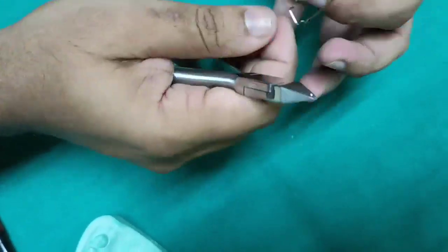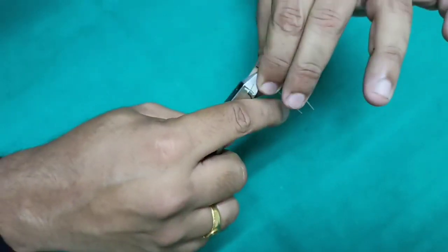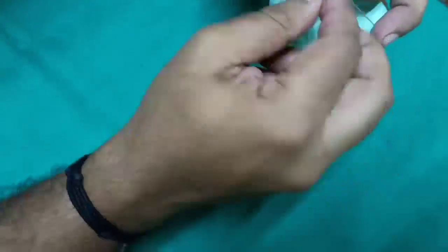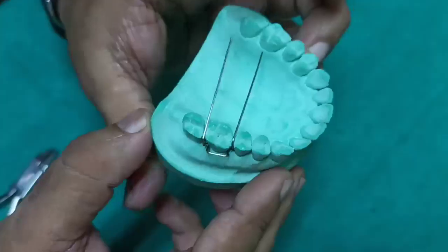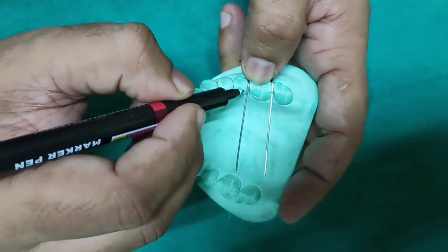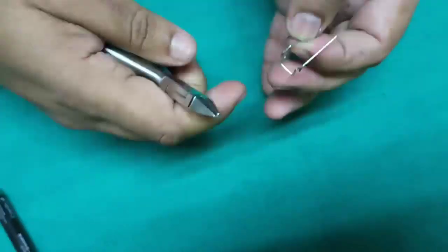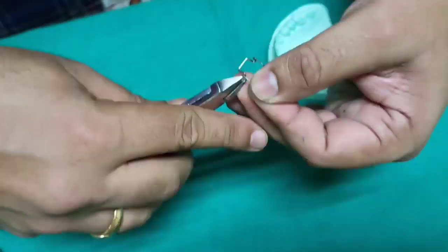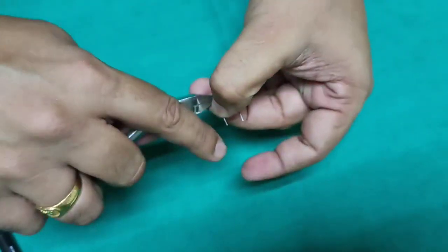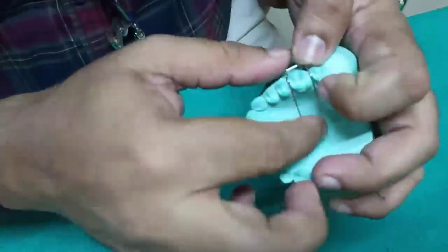Then the tag arm is bent, passing through the groove between the marginal ridges of the teeth. Any necessary adjustments are made and the second tag is bent in a similar way. The clasp is completed by bending the tags over the contact point between the two teeth into the lingual embrasure and then bending the wire slightly away from the palatal mucosa.